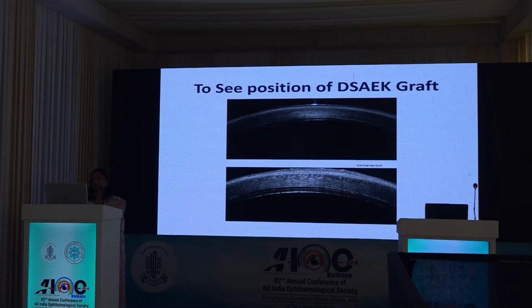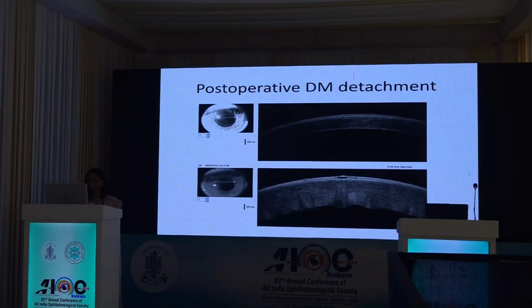Sometimes on the slit lamp it's not possible to visualize graft detachment because of the corneal edema. So in this particular patient, rebubbling was done, and you can see that post rebubbling, the graft is very well attached with the absorption of the corneal edema.